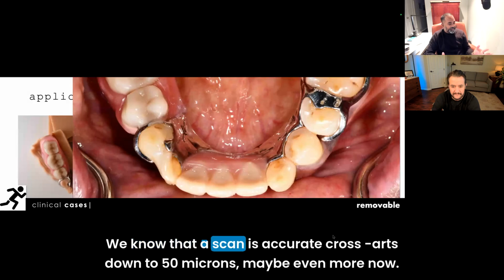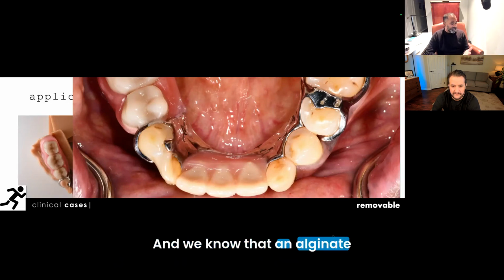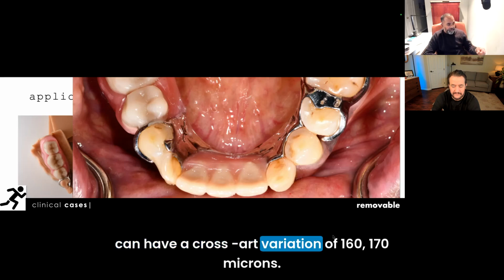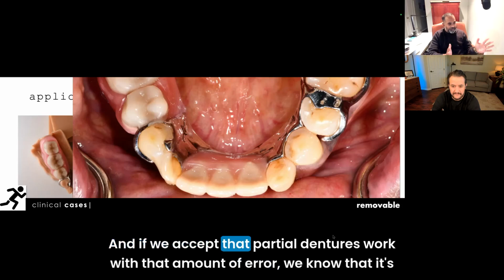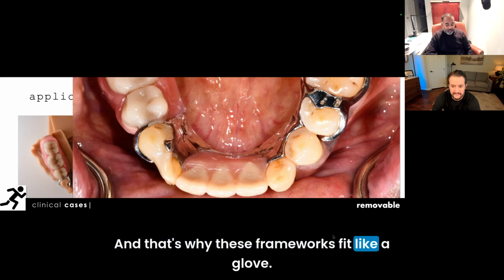We know that a scan is accurate cross-arch down to 50 microns, maybe even more now. And we were all taught in dental school that you could take an alginate to do a partial denture case. And we know that an alginate can have a cross-arch variation of 160, 170 microns. And if we accept that partial dentures work with that amount of error, we know that it's going to work really well with 50 microns. And that's why these frameworks fit like a glove.